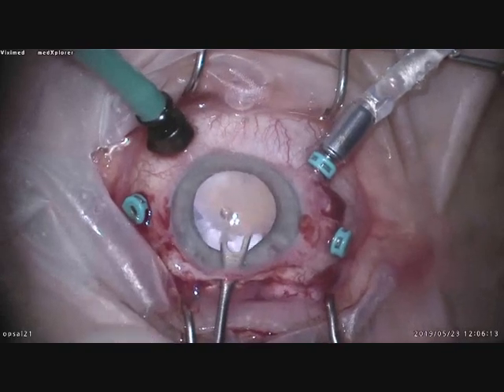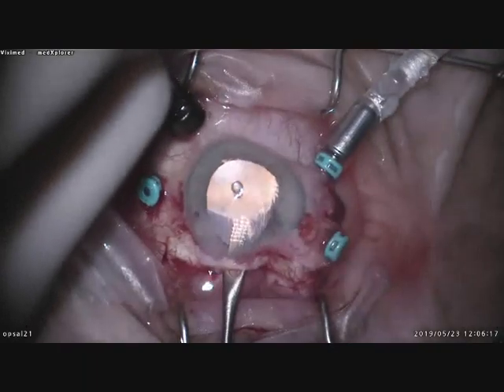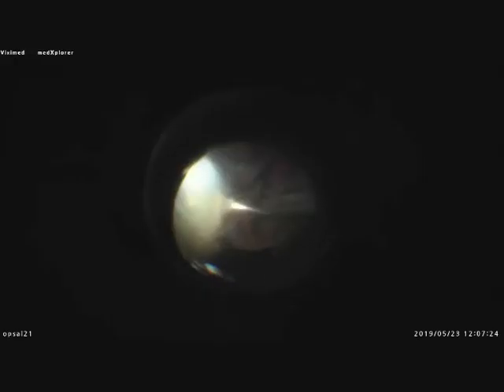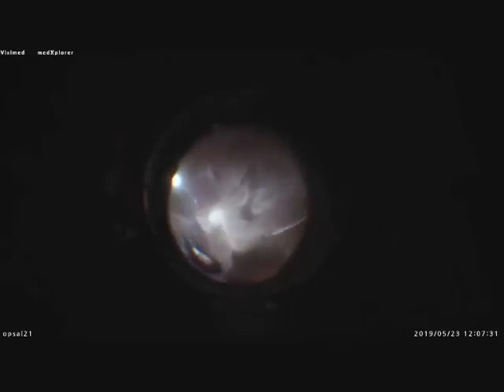This is the extraction loop. I'm trying to extract now. Now I lost it. It dropped again, and it drops behind the giant rupture. So this is not so easy. Let's try again.